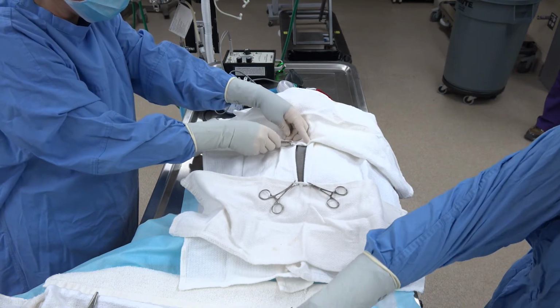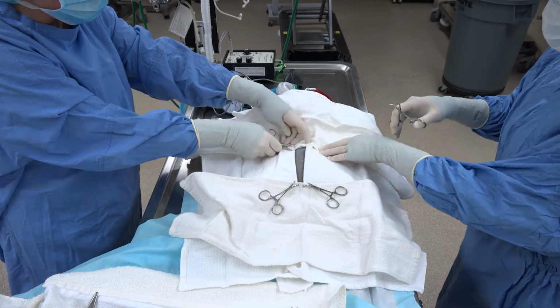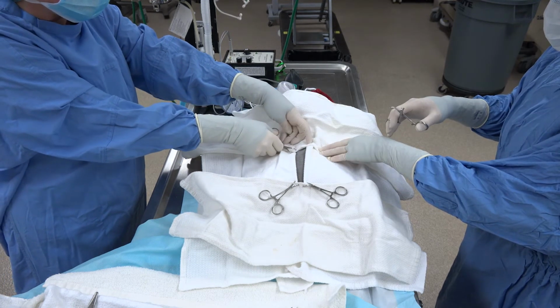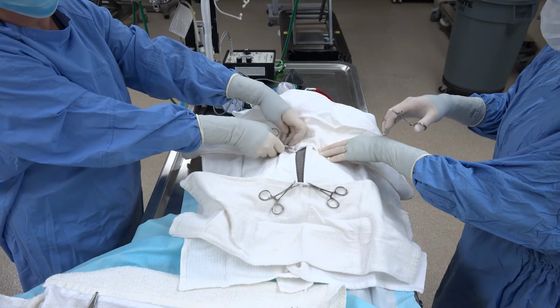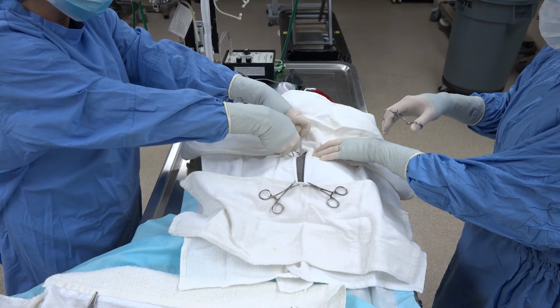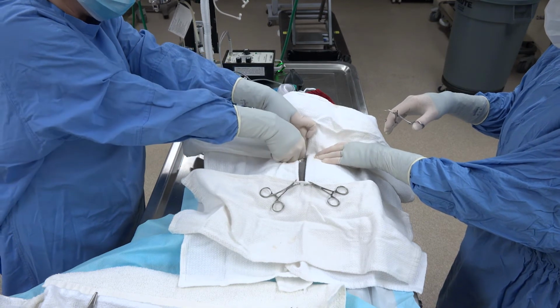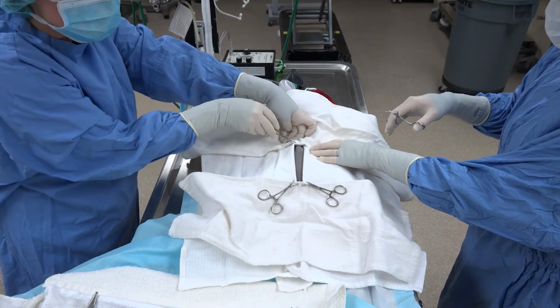Uh-oh, shoot, I didn't get his skin. Now what do I do? What you do is you actually just open the clamp because it's dirty underneath. Every time you penetrate with the clamp, it's dirty underneath. So you just open it, push harder to where you grab the skin. Oh, didn't grab it again. Try again. Push harder. Now I got the skin.